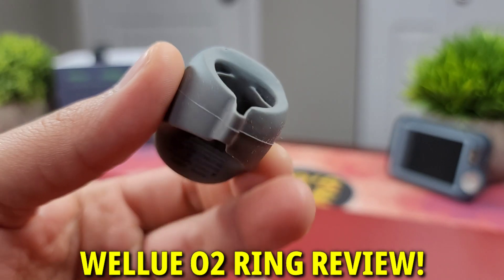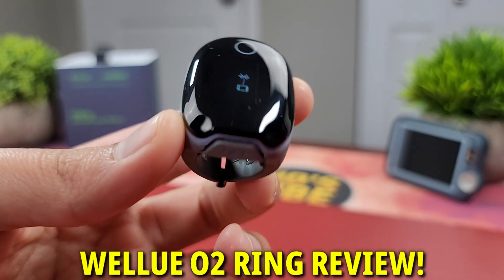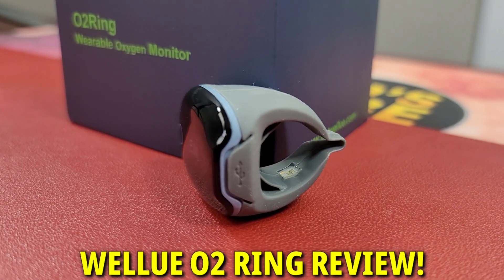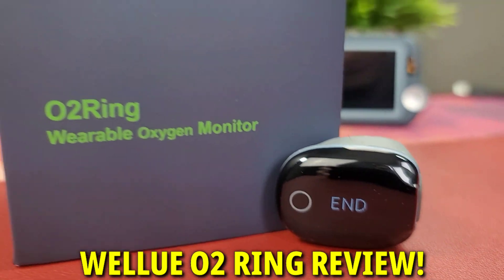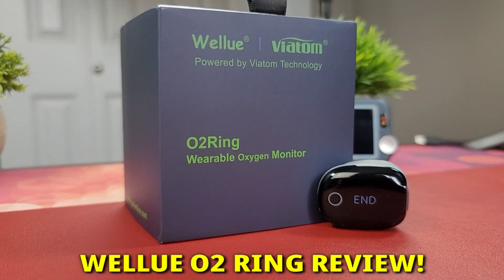They sent out another cool product for my unbiased review — it is the O2 ring powered by Viatom technology, which measures your dynamic heart rate, blood oxygen, and can be used for a home sleep test for sleep apnea.